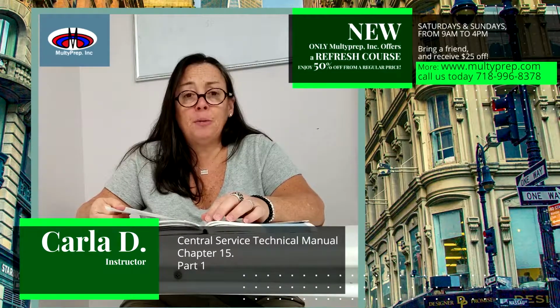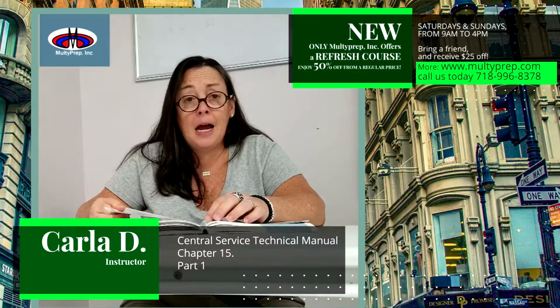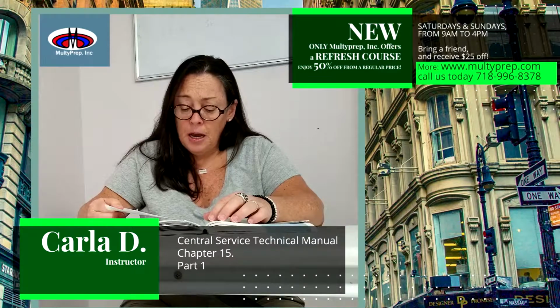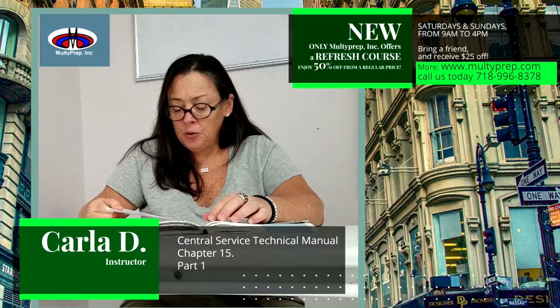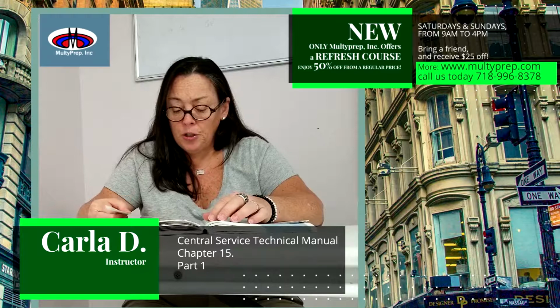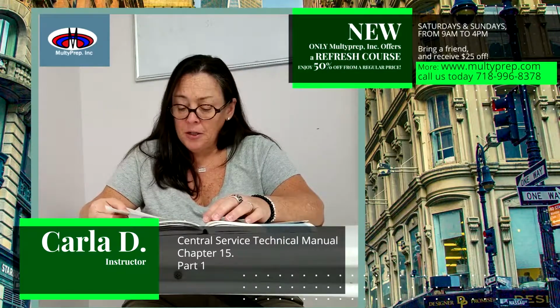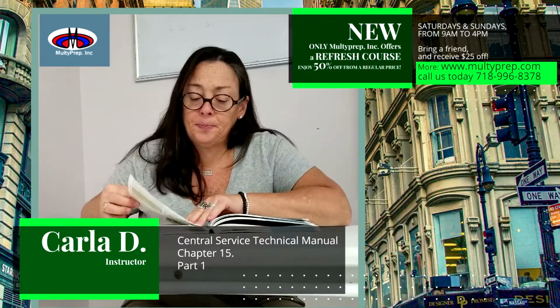Time-weighted average, TWA: the amount of substance employees can be exposed to over an 8-hour day. The National Institute for Occupational Safety and Health, NIOSH, has also developed standards for immediately dangerous to life or health, IDLH, concentrations for low temperature sterilants. Figure 15.1 at the top of page 323 lists the standards established by OSHA and NIOSH for each sterilant.